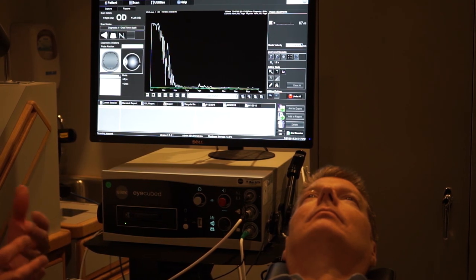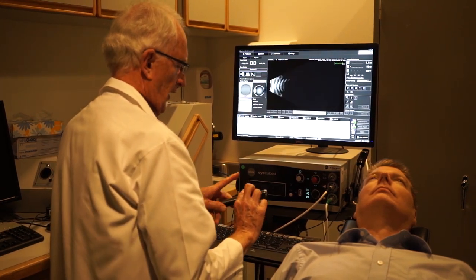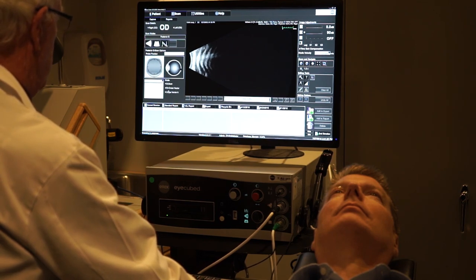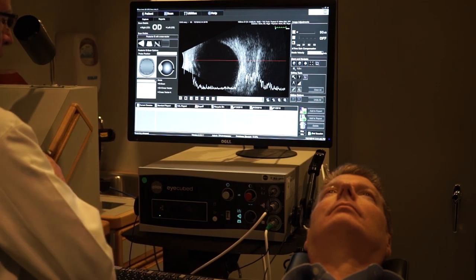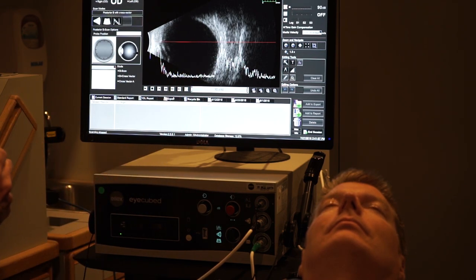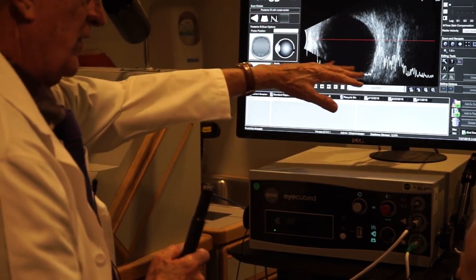That's a summary of the basic A and B-Scan techniques. The B-Scan does have an A-Scan on it called a vector A-Scan, which some people use. I don't find it very useful — it's really derived from an envelope from the B-Scan. Here's an example: here's the B-Scan with the globe, and then there's an A-Scan superimposed at the bottom, but that's not the same as the diagnostic A-Scan that I use. It's derived from the B-Scan envelope and really isn't that helpful in diagnosing reflectivity changes, especially in tumors — we see a lot of melanomas and other eye tumors. In those cases I don't really use it; it's just sort of there.